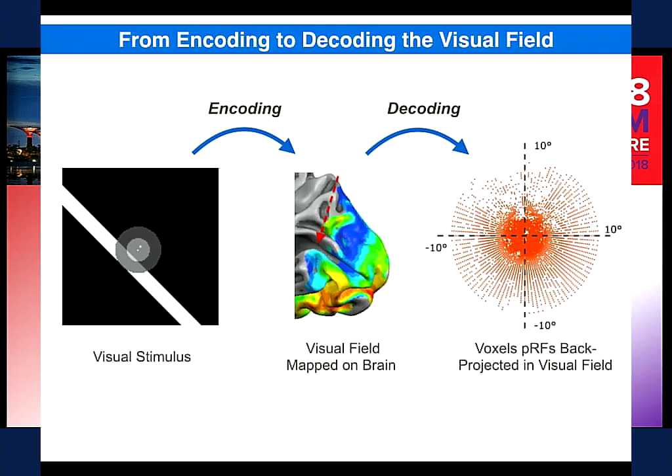And for that, we do the so-called PRF, population receptive field mapping, which is just a more model-driven way to identify the retinotopy of early visual areas. But then we invert these tasks and look at when certain anatomical parts become activated by pure imagery, by just imagining seeing something. We decode back from the known anatomical region in this map back into the visual field. So we highlight the regions which are active here.